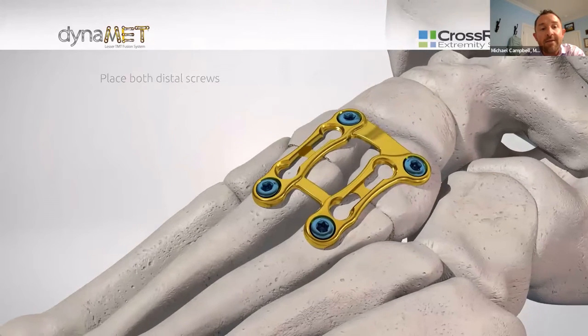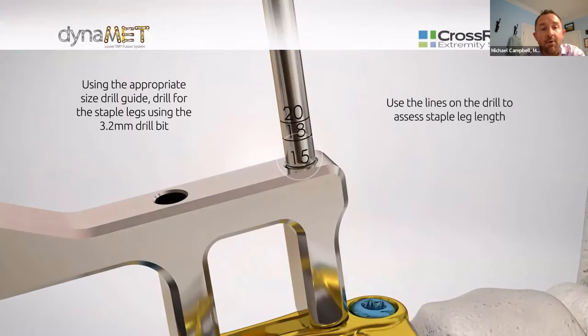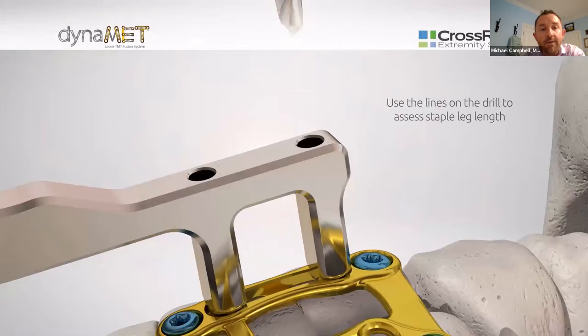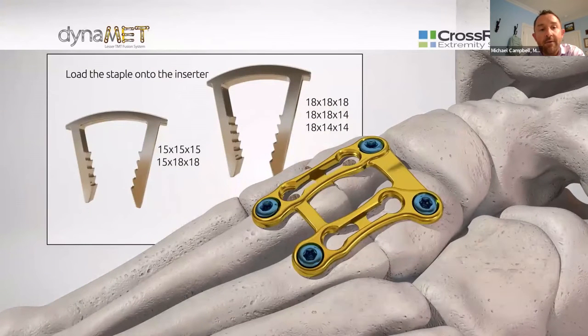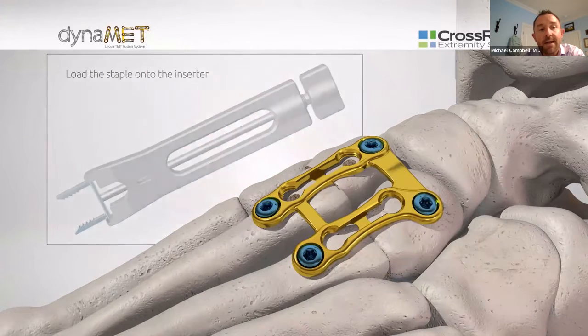So you can fixate those, then everything can come out, and at this point you've maintained a stable construct, and you drill. The drill guide, the 3.2mm drill bit for the staple is neat because it has markings. So when you put it through that drill guide, you can see exactly how deep you're drilling and drill to the appropriate depth.